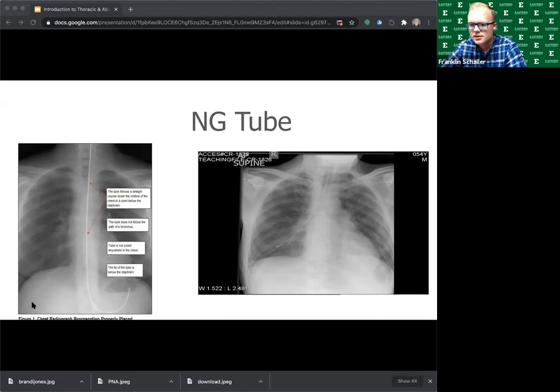Seeing some hands go up. Nurses generally do not like doing this procedure, but I guarantee you the patient doesn't like it even more. But looking at these images on the left, this looks like a beautifully inserted NG tube, probably inserted by one of you guys because you guys are so darn intelligent.